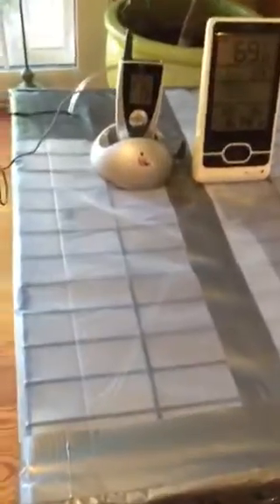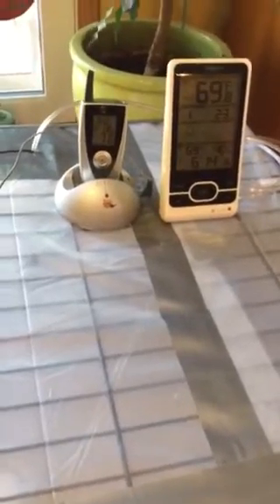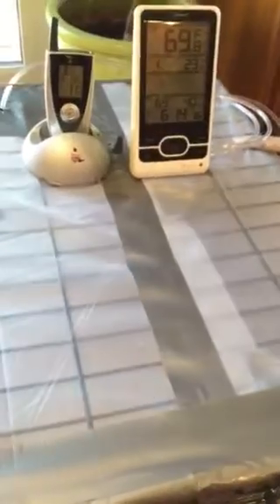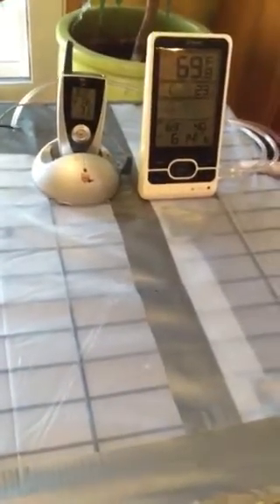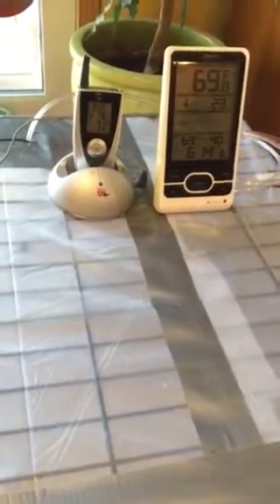Now up top, you'll see that I have a couple thermometers. Now one of the thermometers is a meat thermometer, which I actually put in the oven to cook a roast. And one problem we had is that you must monitor the temperature inside of the cage. With the dog breathing in there, it could actually get like a sauna. So you really need to know what the temperature is.